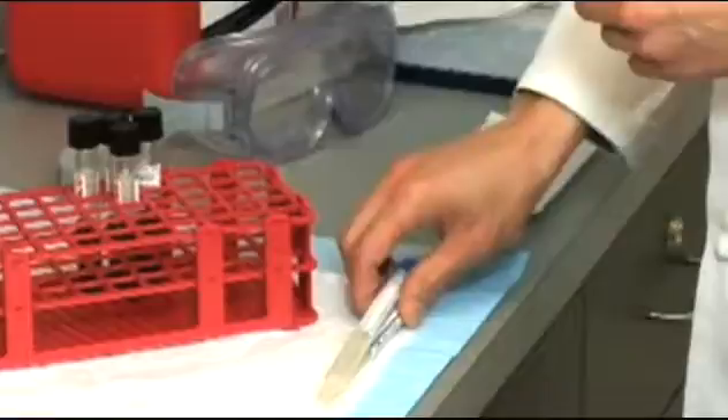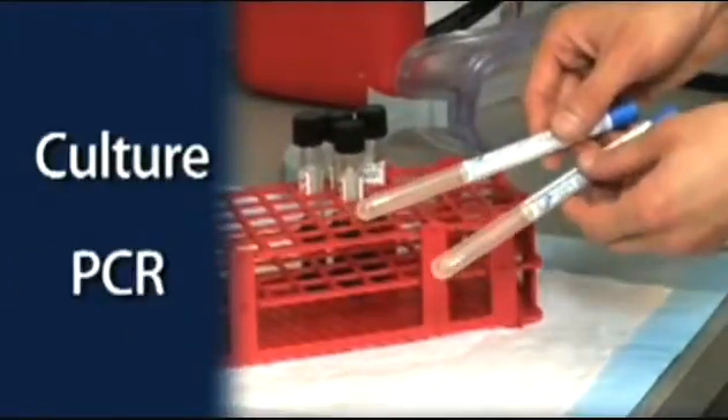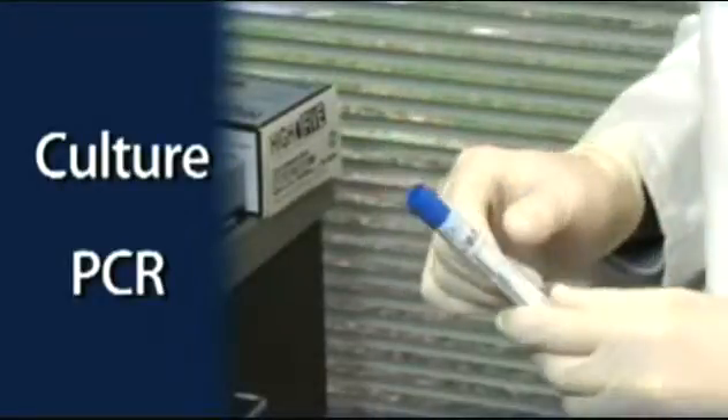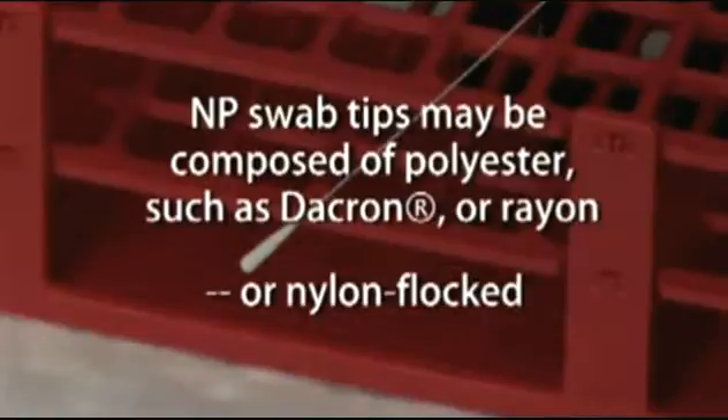Ideally, you should collect two NP swabs: one to be used for culture, and one to be used for PCR. One swab for both culture and PCR is also acceptable. The NP swab tips may be composed of polyester, such as Dacron or Rayon, or they may be nylon flocked.